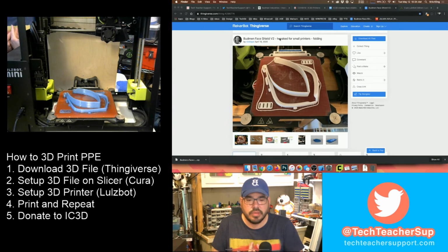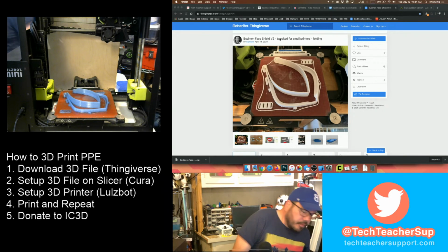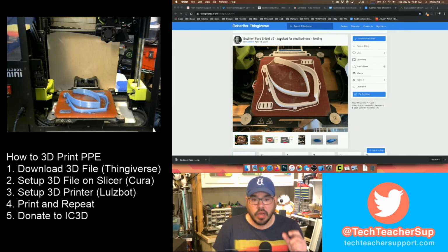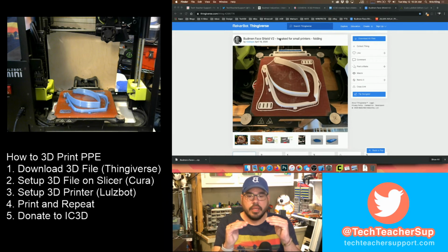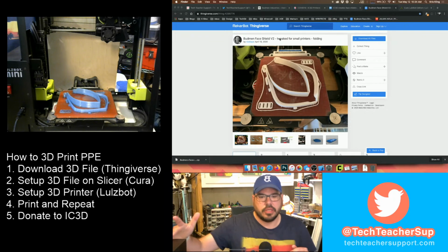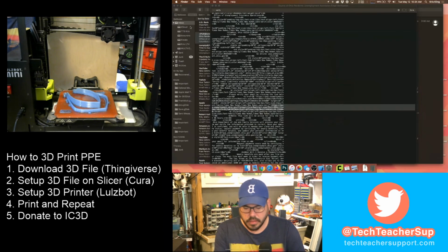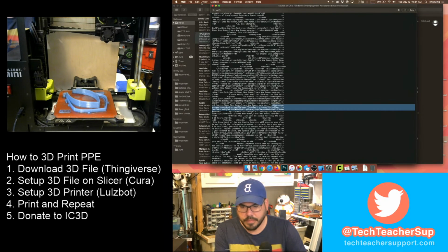Now what we need to do is set it up on our slicer. So a slicer is the software on your laptop that takes your 3D piece and sends it over to the printer. All right, and so I'm going to show you how to do that. So look up at our screen here. I'm going to hide Google Chrome.